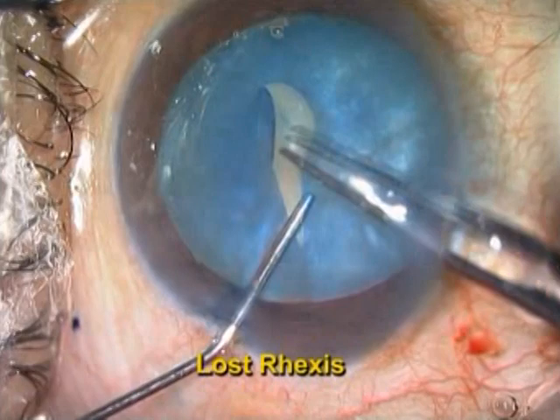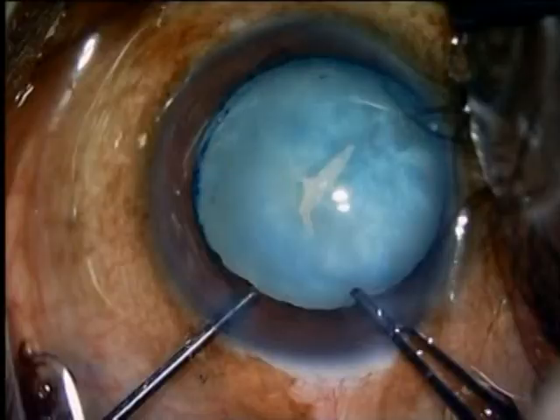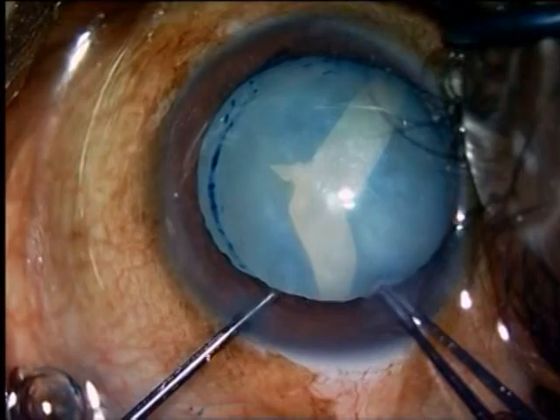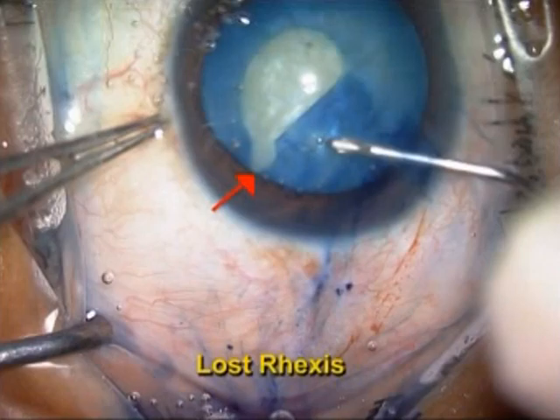White intumescent cataracts are a very common problem in a country like India. The main problem associated with white intumescent cataracts is a very high intralenticular pressure, which makes the rhexis very difficult. The Argentina flag sign, wherein the rhexis gives way in two directions, is not uncommon in white intumescent cataracts.